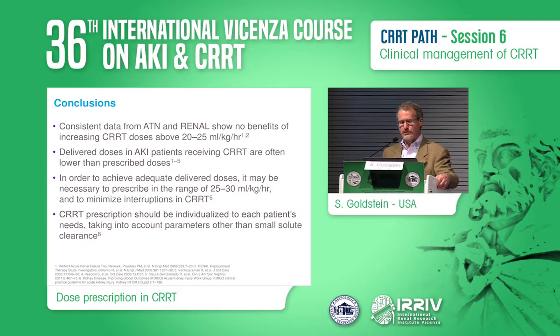But this dose should be individualized to meet each patient's needs, taking into account factors other than small solute clearance. Urea clearance is not the holy grail. It's not the only thing we should be paying attention to, but it is the first thing we should pay attention to.